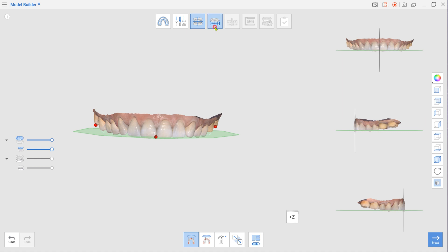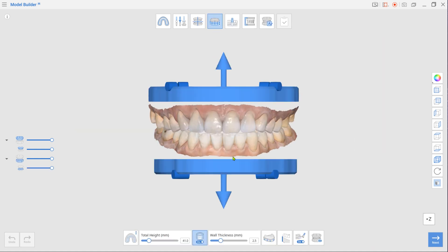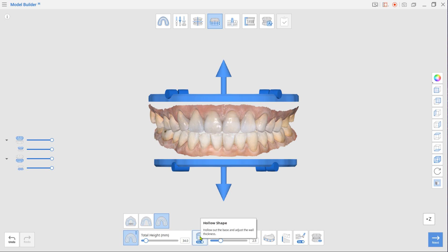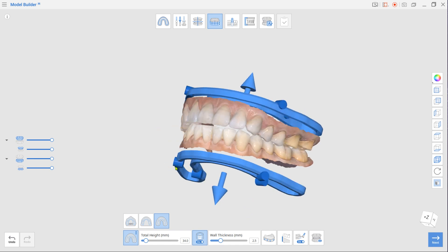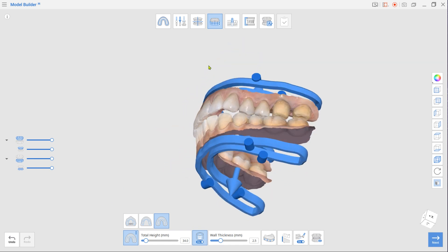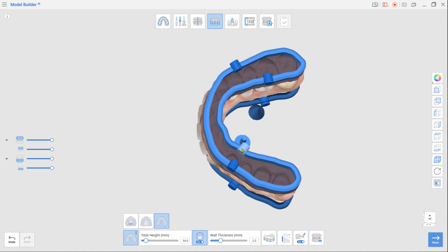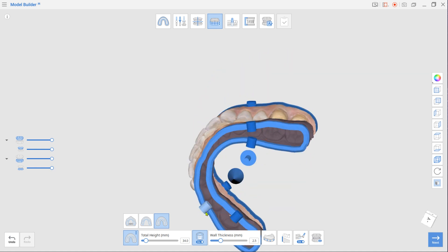Next is Base Creation mode. Drag arrows up or down to adjust the base height and select Plateless Mode as the base type in the toolbox. To minimize consumption of resin material during printing, leave the Hollow Shape option on. Create drain holes and ensure they are not placed near your working dies. Adding drain holes will prevent blowouts caused by cupping.